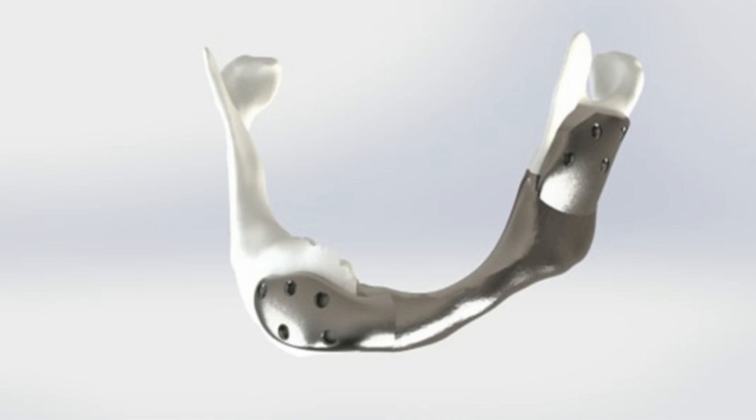The implant can no longer break, and the innovative orientation of the fixation screws ensures that the implant stays in place.